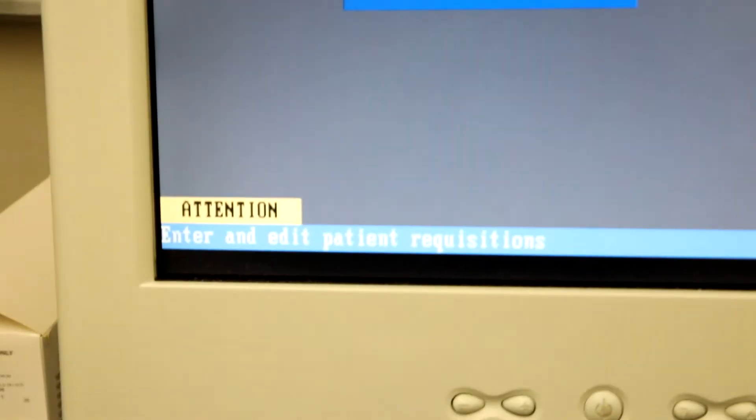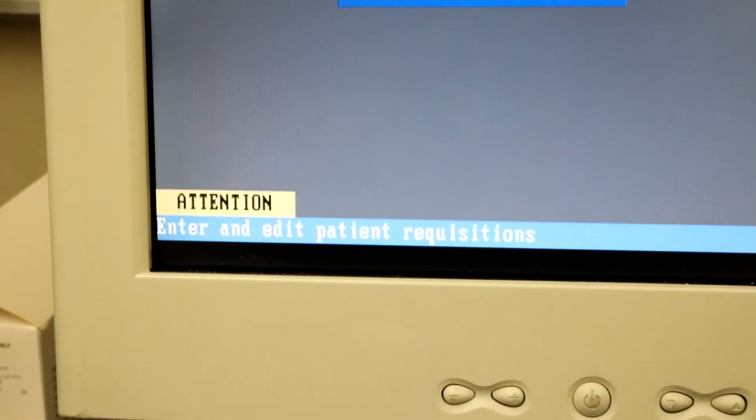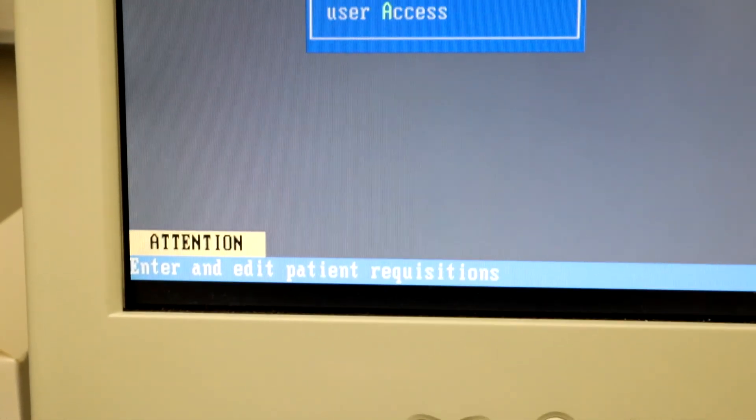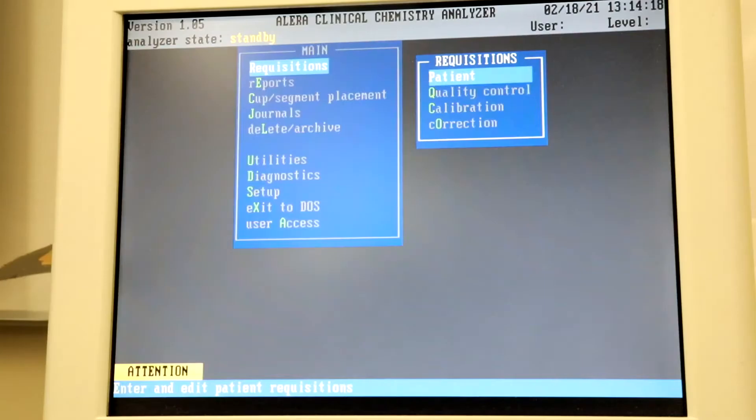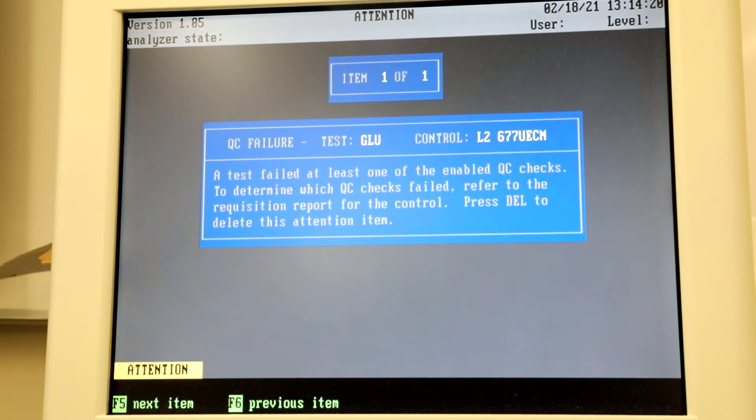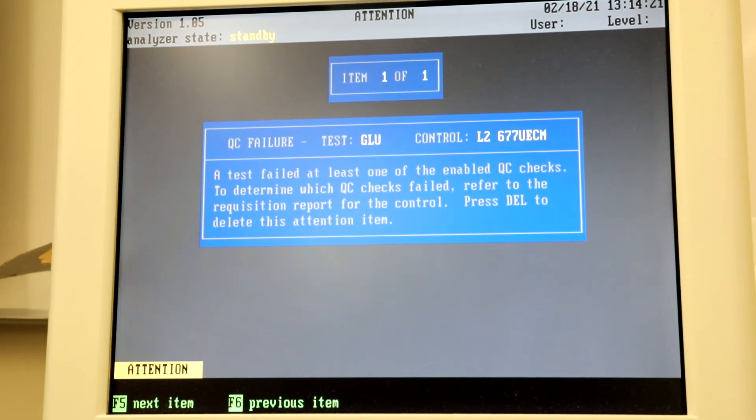If it fails, an attention box will flash on the bottom left of the screen. Hit F9 to see what failed. Repeat Failed QC.